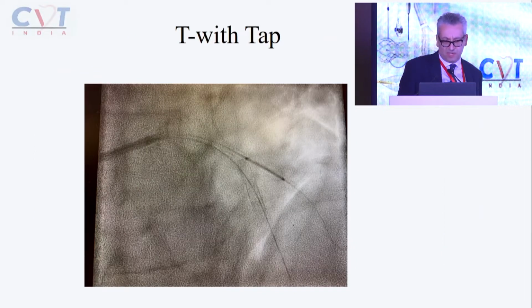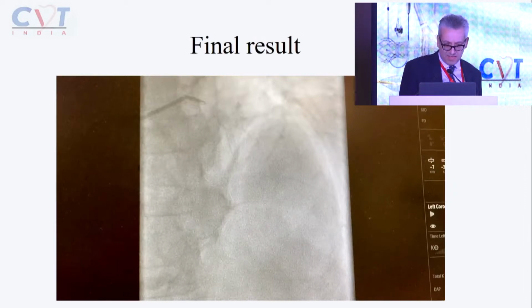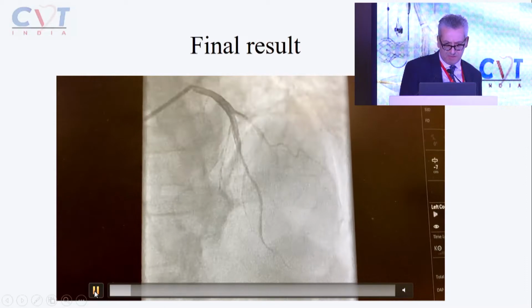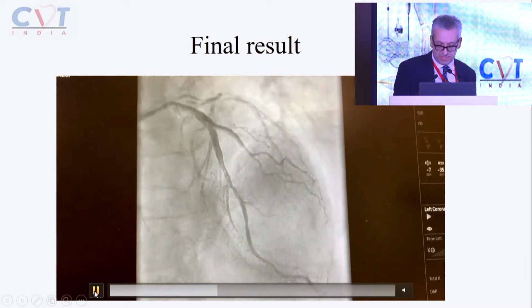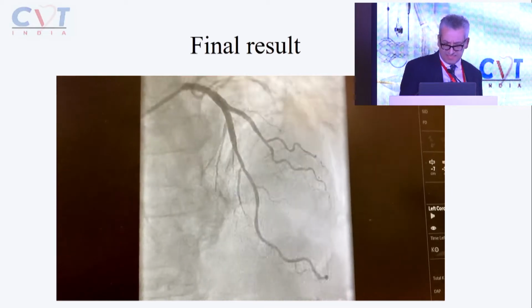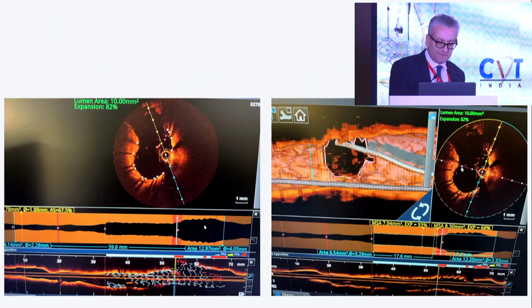So I undertook a T with a TAP. Again, I'm not going to show videos, it's straightforward. And this is the final result. And I'm going to show you some more OCT. So this is the final result, good looking OCT result. This is the OCT, and the OCT is very useful here.